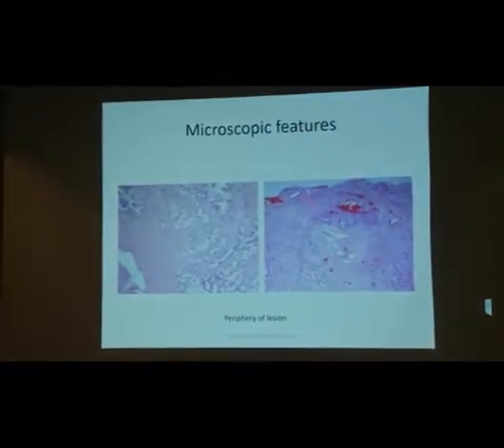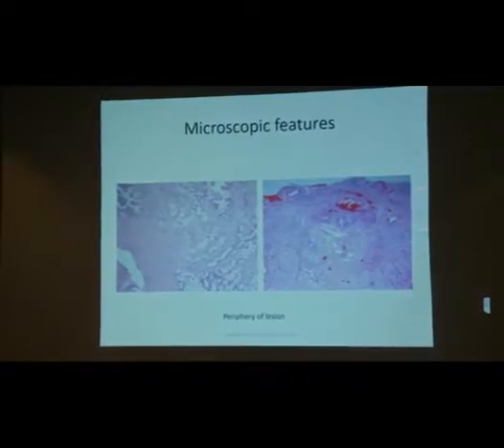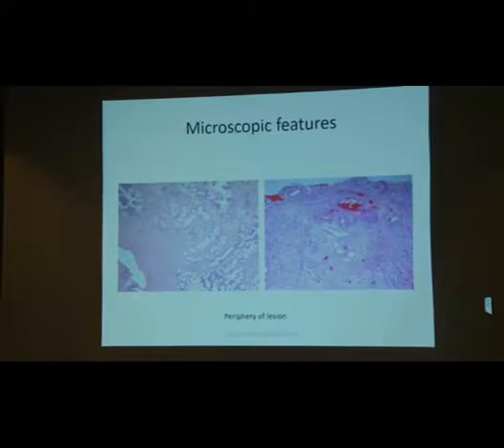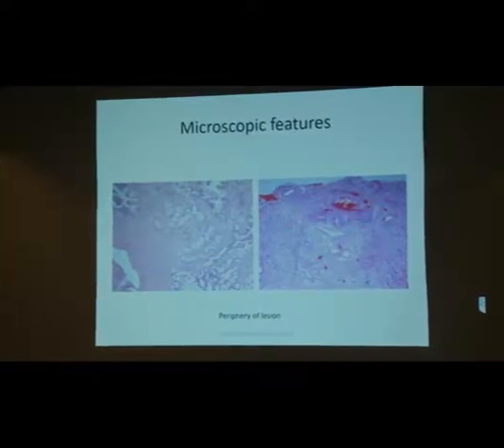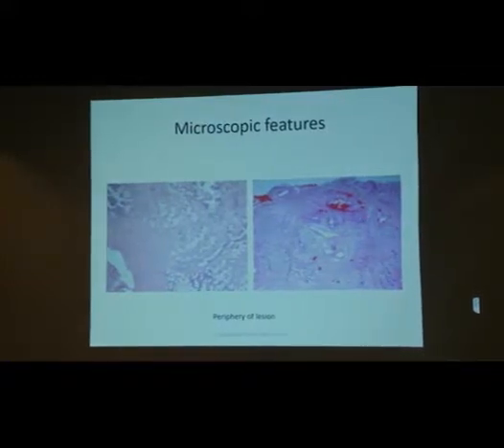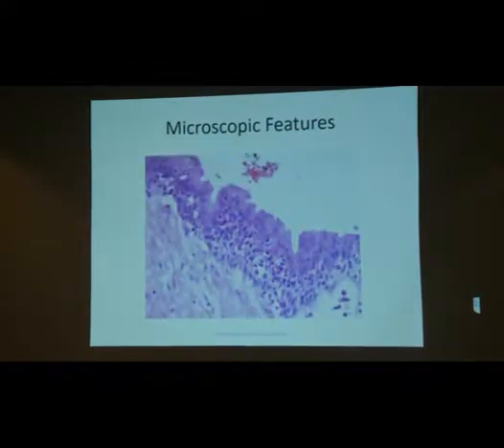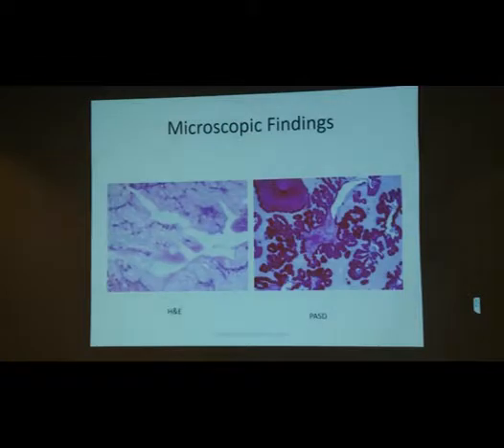And this is the periphery of the lesion. You can see that it's not quite circumscribed. It's sitting next to these rather thick walled blood vessels. Well, we're not surprised because that's the vulva, so you can see some thick walled blood vessels there. And it's not encapsulated. Another view. This is inflammation. Over here, you can see that this epithelium is infiltrated by lymphocytes, neutrophils, plasma cells.